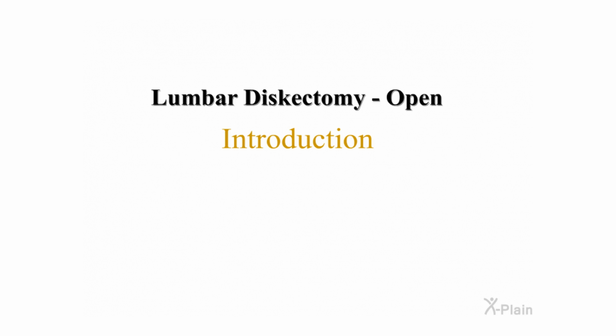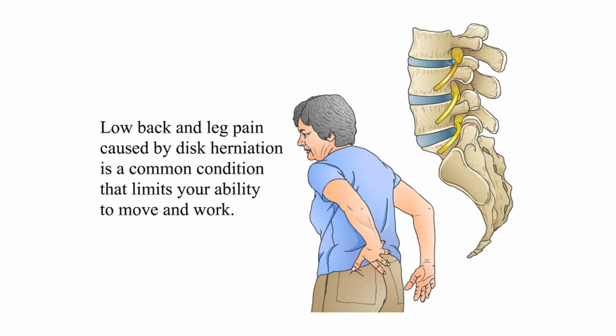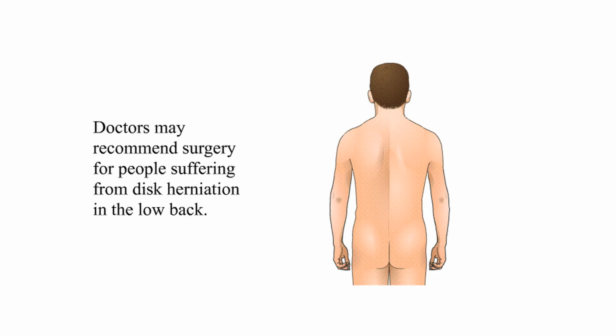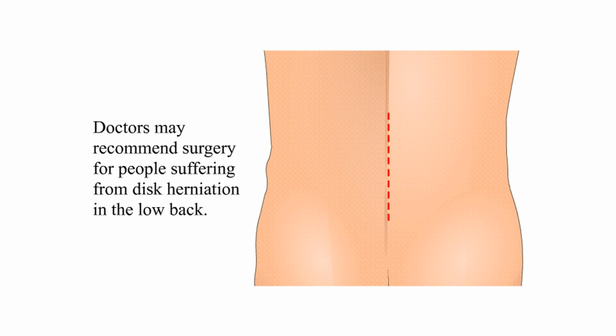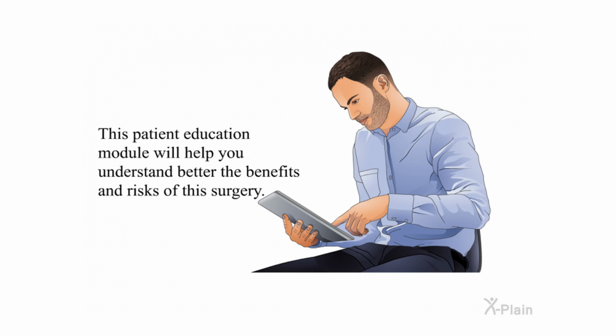Lumbar discectomy, open. Introduction. Low back and leg pain caused by disc herniation is a common condition that limits your ability to move and work. Doctors may recommend surgery for people suffering from disc herniation in the low back. If your doctor recommends surgical treatment for your condition, the decision whether or not to have surgery is also yours. This patient education module will help you understand better the benefits and risks of this surgery.